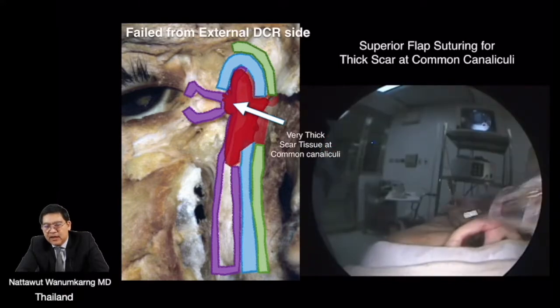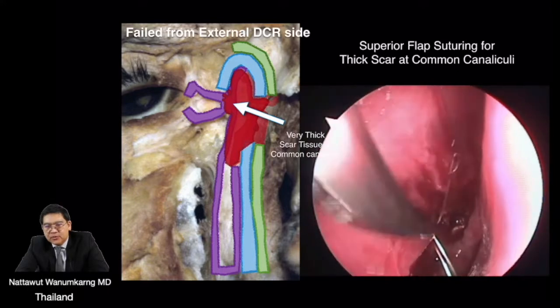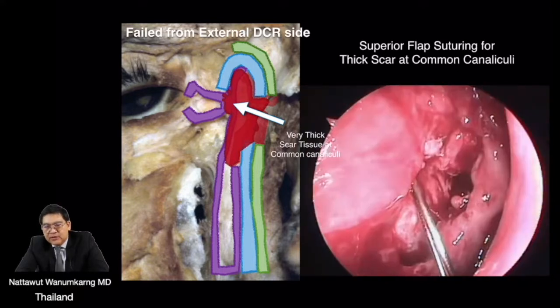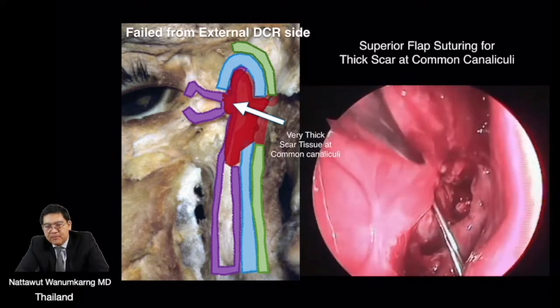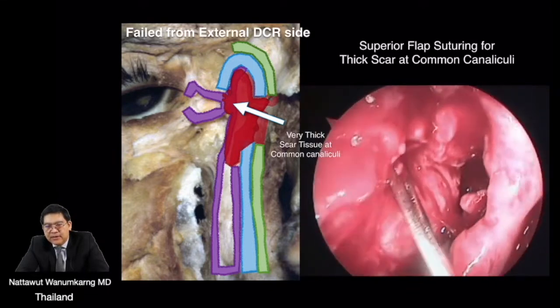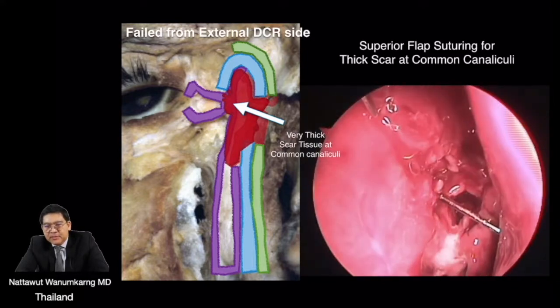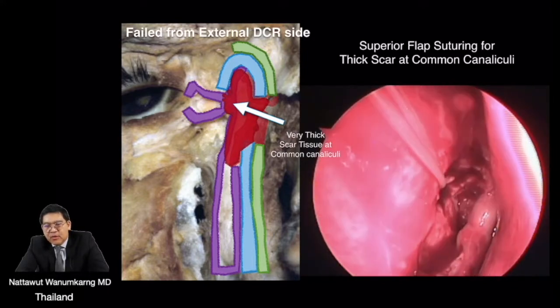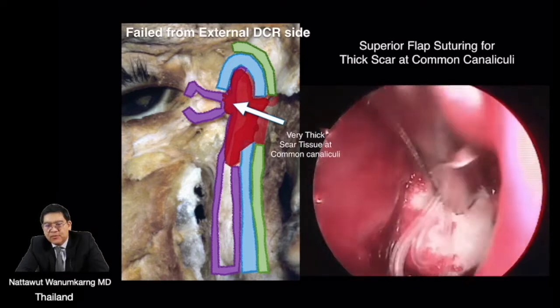In this technique, I think we can fix the superior flap superiorly to the nasal mucosa and prevent the superior flap from moving downward, and prevent recurrence of the scar tissue. After that, the steroid injection, silicone stent and gel foam could be applied.